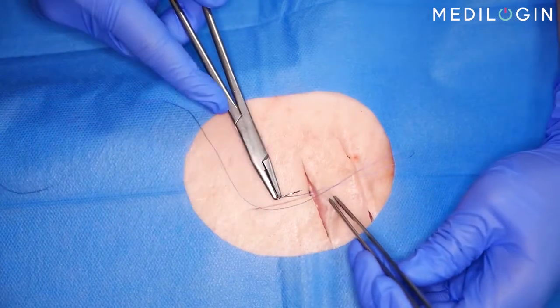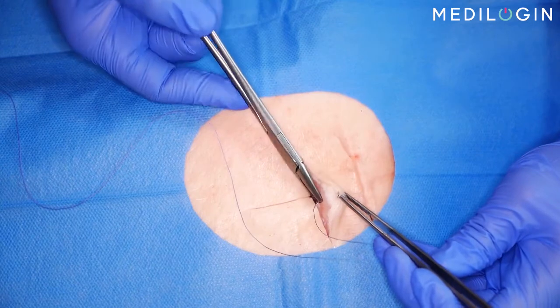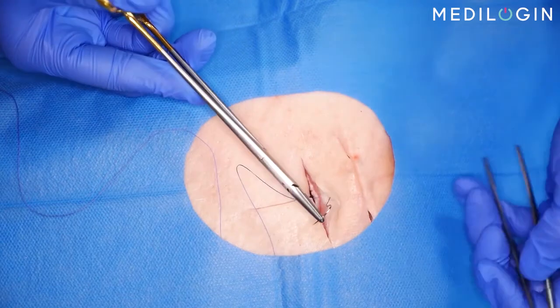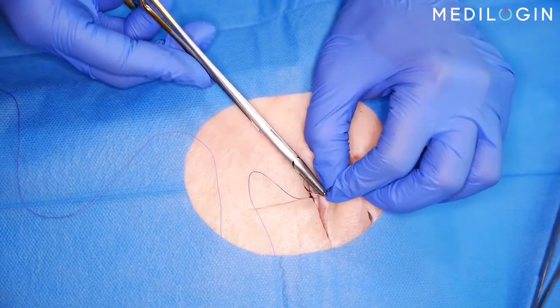The needle bites into the deep subcutis and exits from the dermis on the same side. Use a 180-degree supination movement of the wrist to precisely guide the needle. Then draw the suture through and reseat the needle in the needle holder.